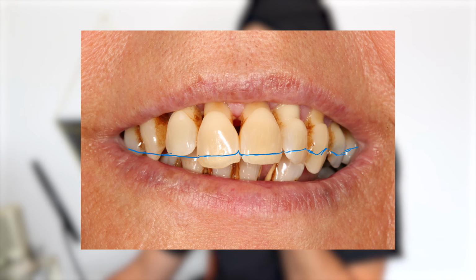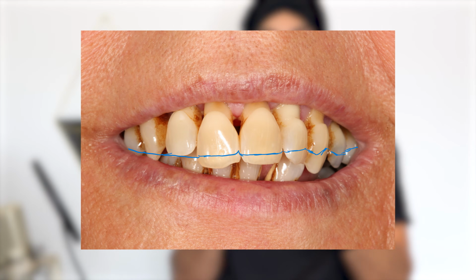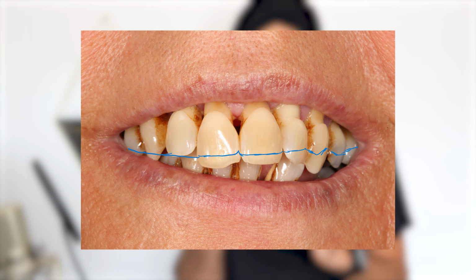So we can see that what I've done is drawn on this photo to help my lab get the ideal position of the teeth, because they can look at this and say, okay, make these front teeth 1 or 2 millimeters shorter, one of the side teeth looks absolutely fine, but the other teeth need to be a little bit shorter. So they've got to gauge where they are.